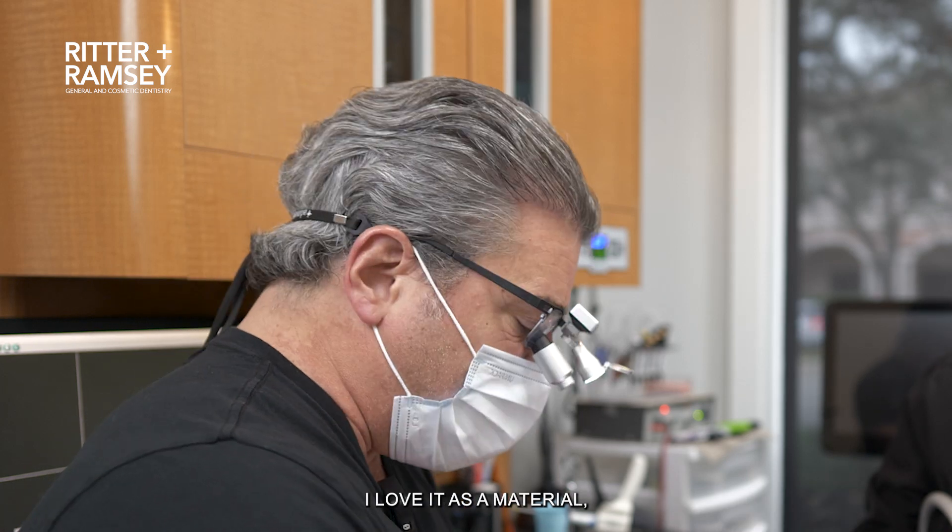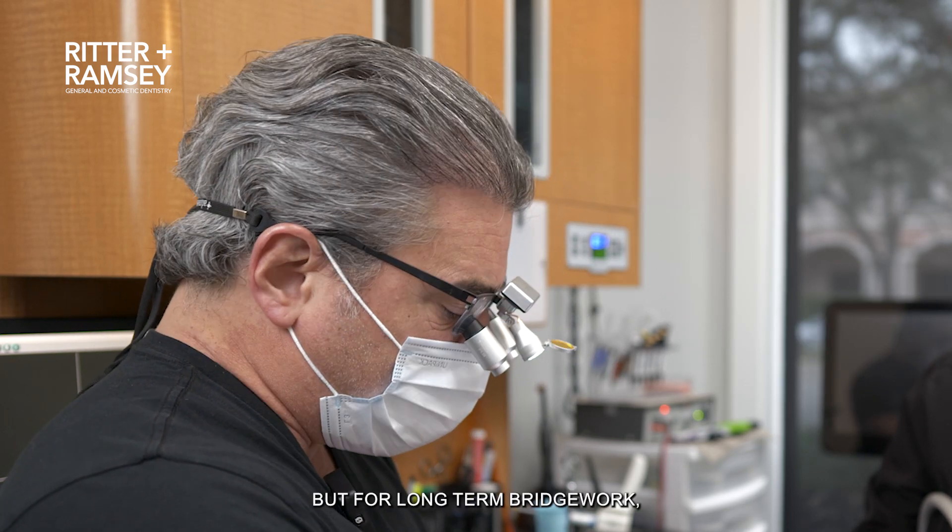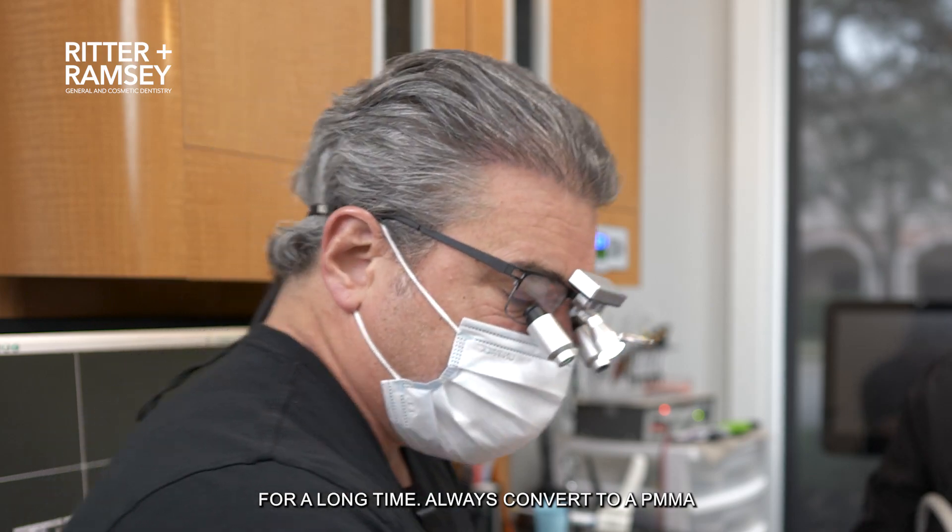Luxatemp is great — I love it as a material. But for long-term bridge work, things that are going to be in the mouth for a long time, always convert to a PMMA.